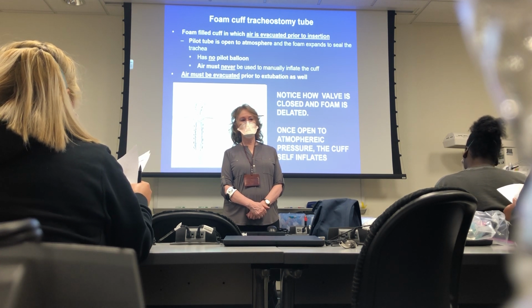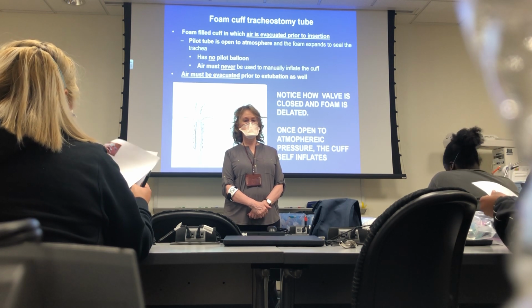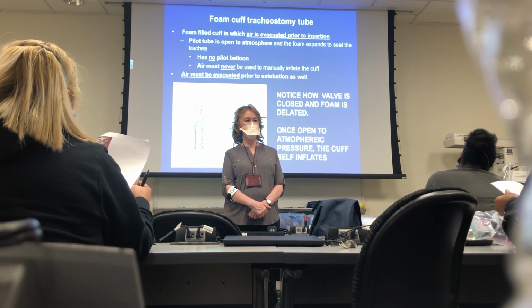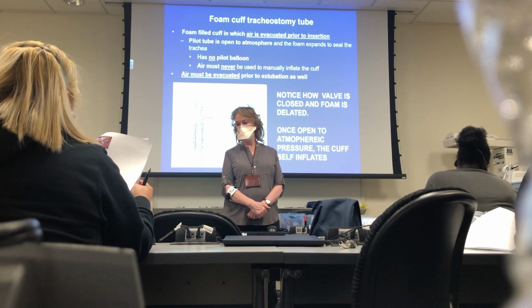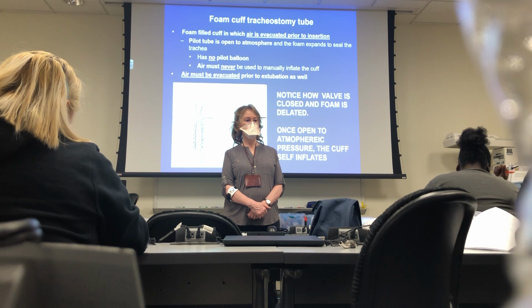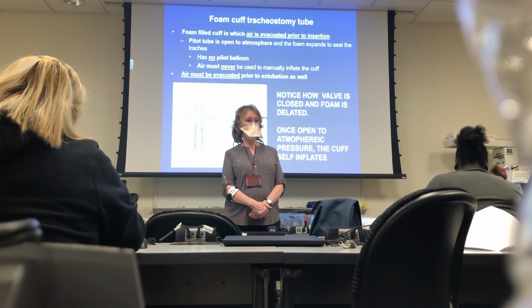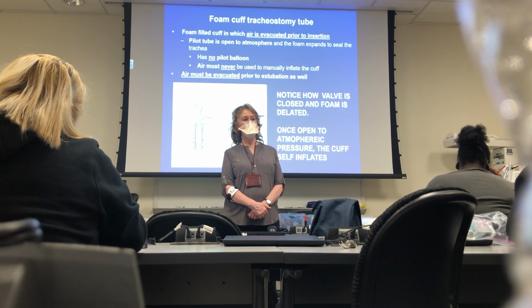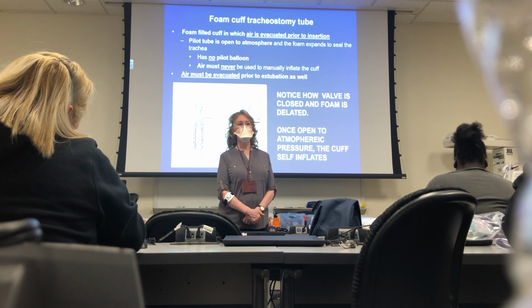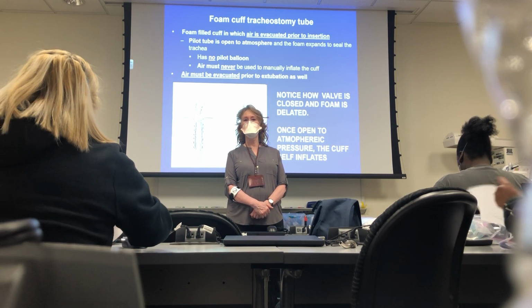You're looking for the foam cuff trach tube. The one you just looked at. Did you find it? Let me see. Yeah, there's the foam cuff right there. Okay, now you're looking for the King tube.